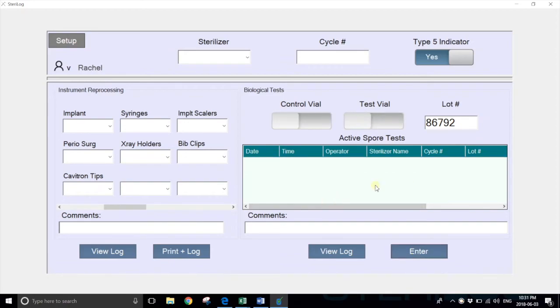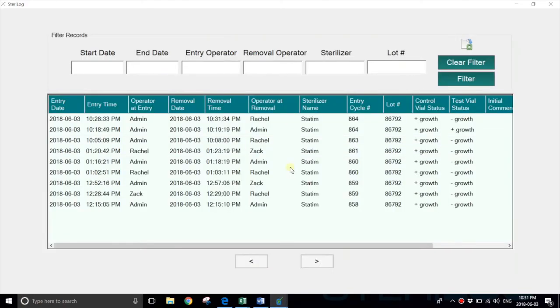Now the spore test has disappeared from the active spore test log and has been passed to the historical log, where you can see the timestamp of entry, the timestamp of removal—there should be a 24-hour gap for the 24-hour indicators—as well as the operator at entry.